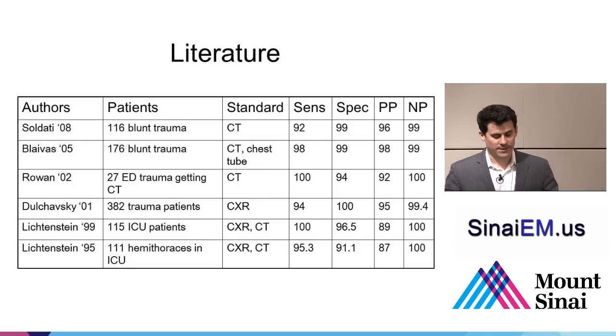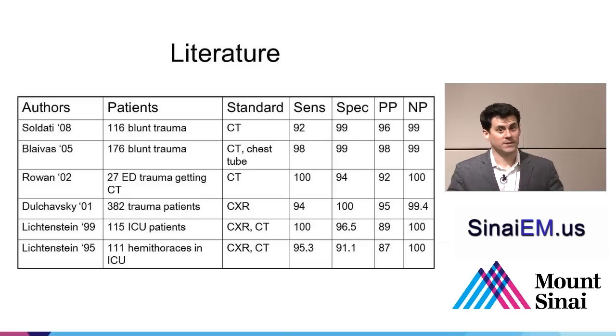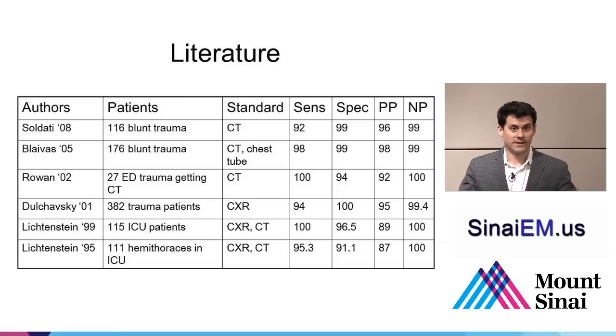With a lot of literature to back it up, mostly the initial literature here is from Daniel Lichtenstein, and this took place in the intensive care unit where he works in France. Comparing chest x-ray and CT scan in hundreds of intensive care unit patients demonstrated excellent test characteristics of thoracic sonography for detecting pneumothorax. It was very soon after picked up by surgeons, radiologists, and emergency physicians looking at this same entity and whether lung sliding could demonstrate pneumothorax in the trauma bay.